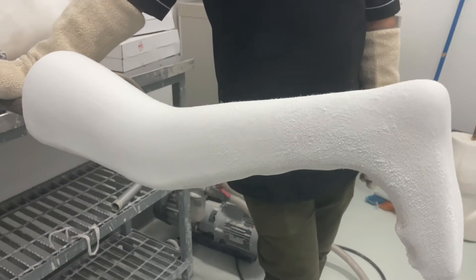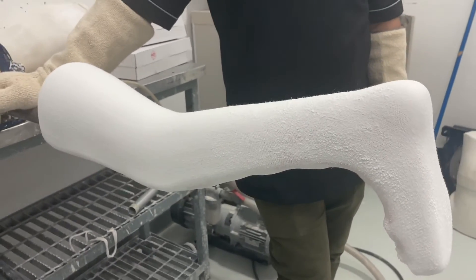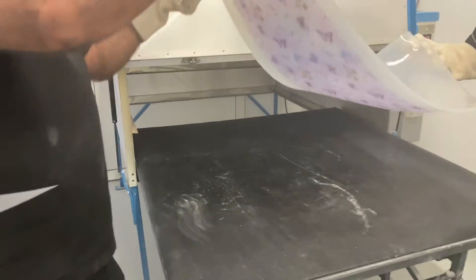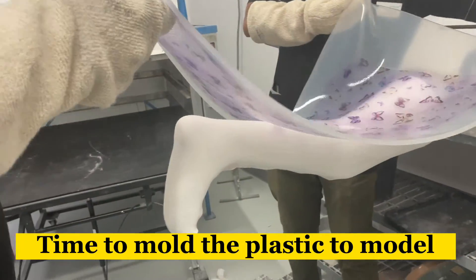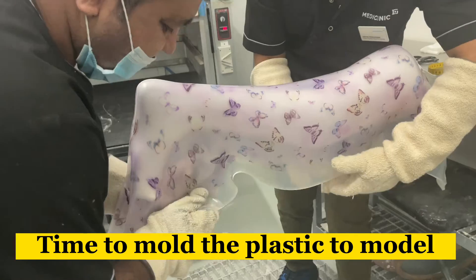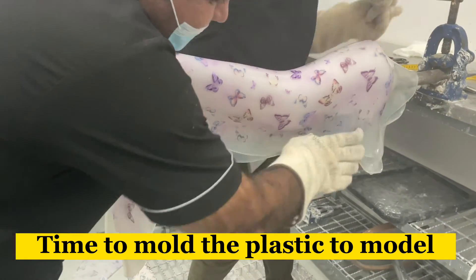In the meantime, if you have anything to prepare for molding — any preparation needed on the model — do that and then start the molding process. For molding big models, we always need two persons; if it is a small model, one person can do it.